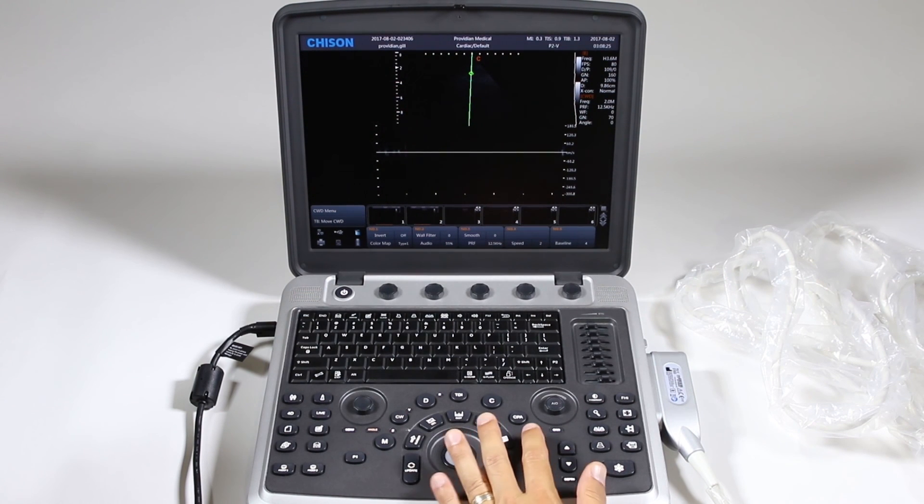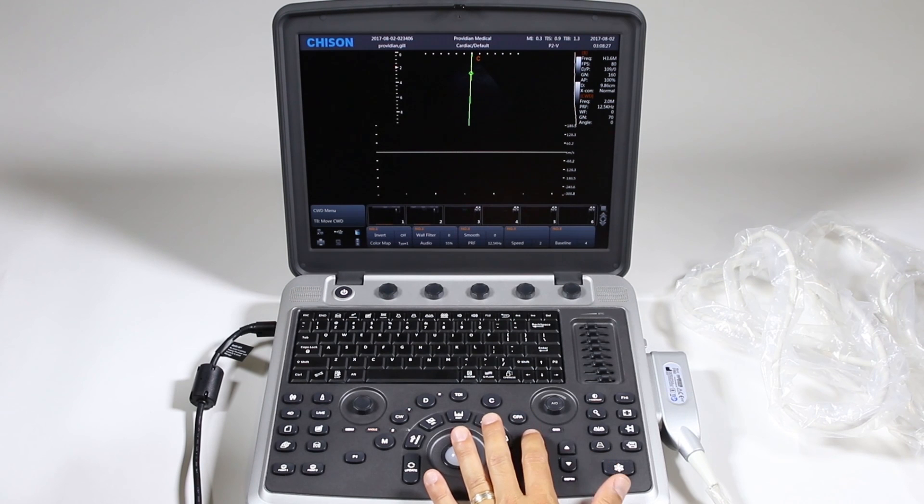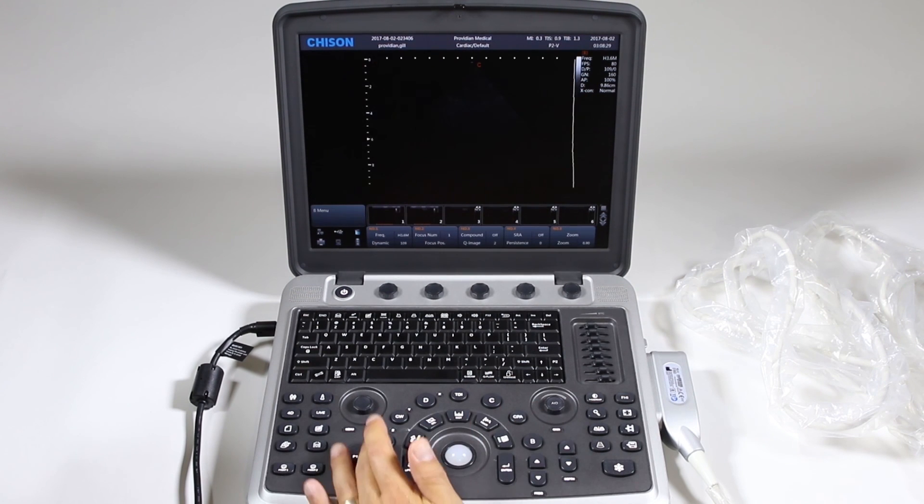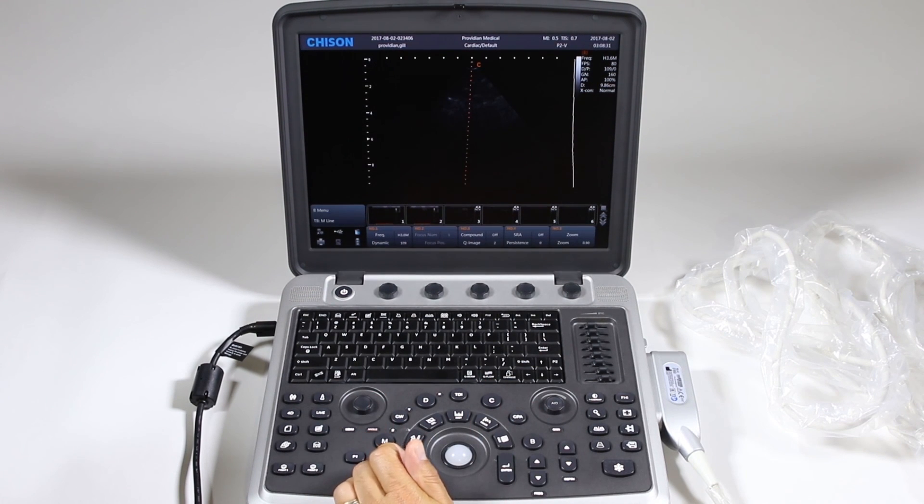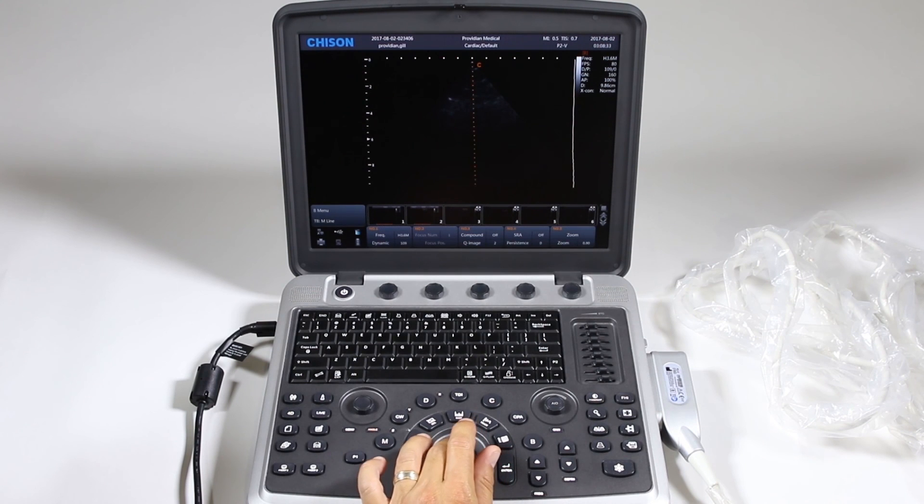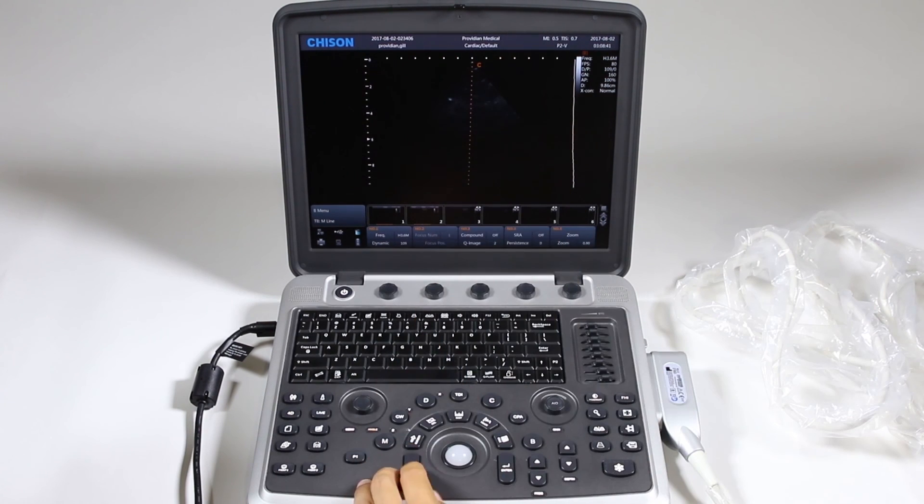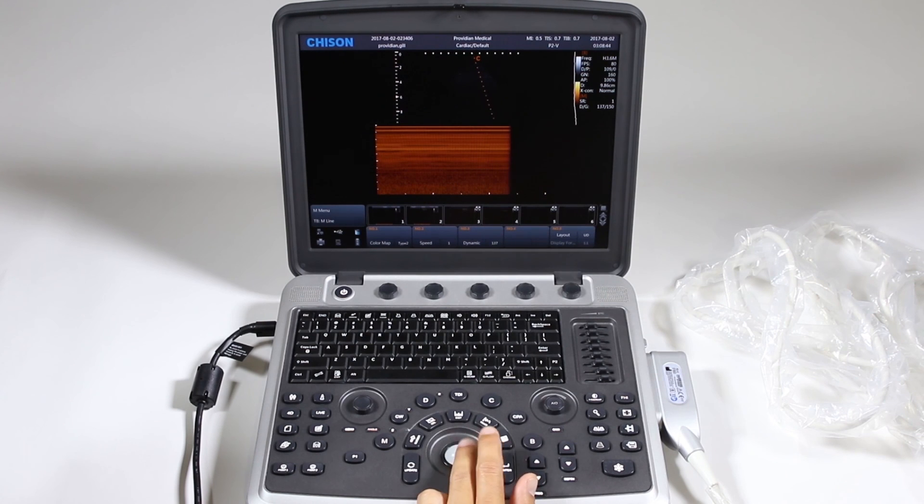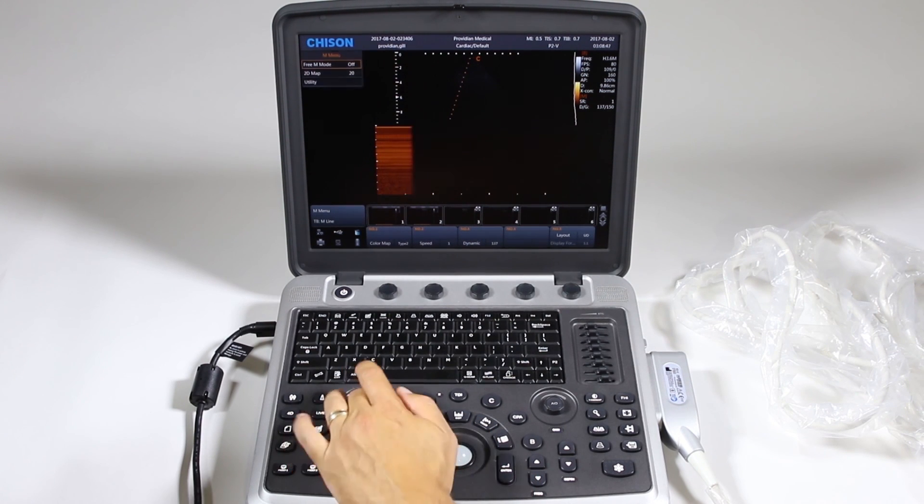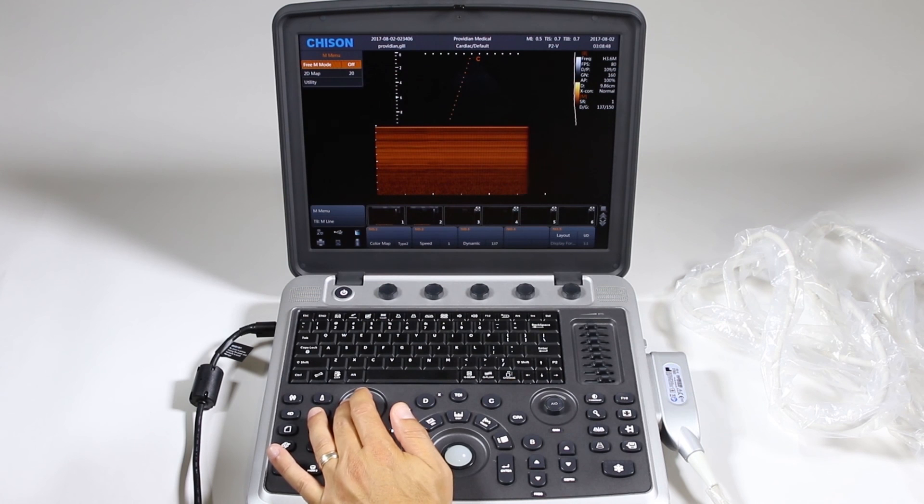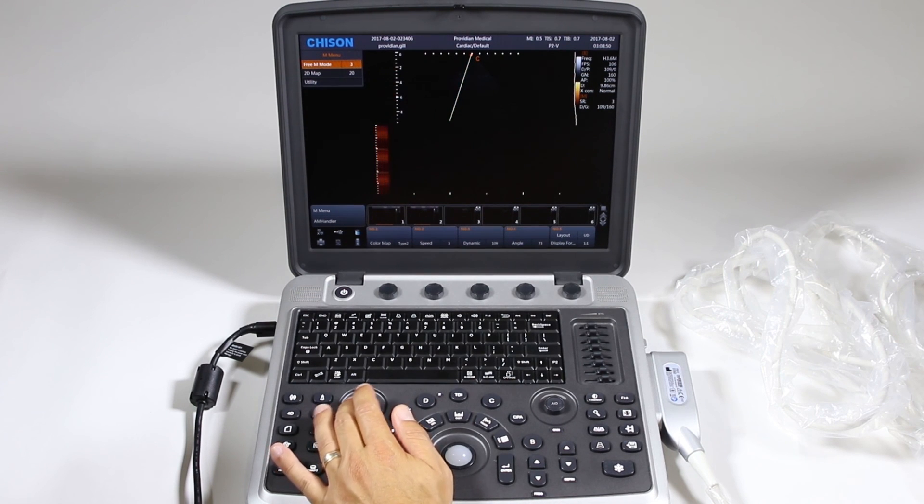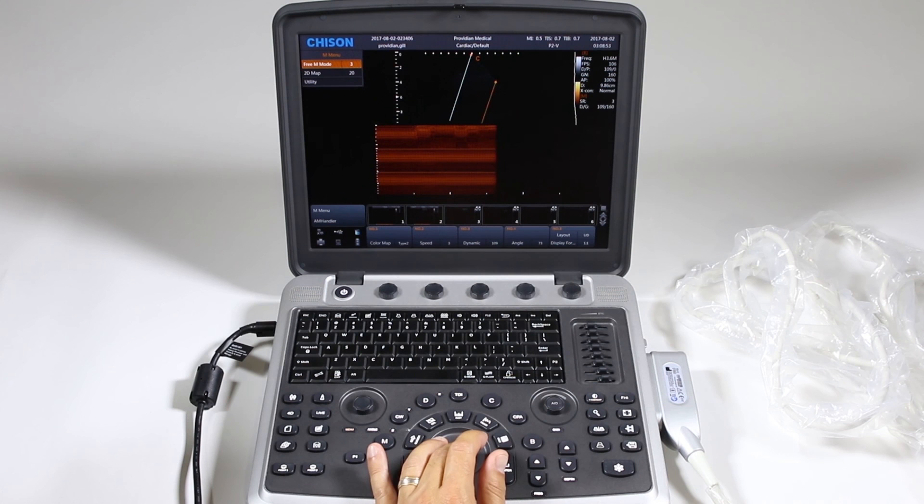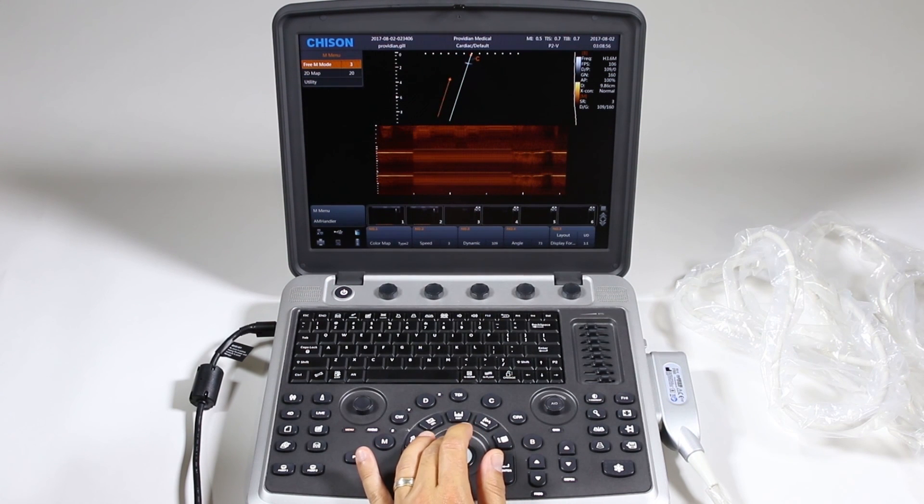But one other thing while this probe is attached is you have something called anatomical M mode. Go back to B, hit M, it is called free M mode here. Just get your M line, click update and normally you can just change it this way. Go to here, go to free M mode, click, turn it on and now I can move that structure to get a different view.